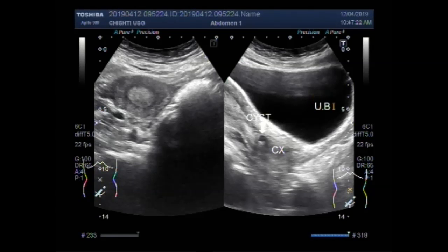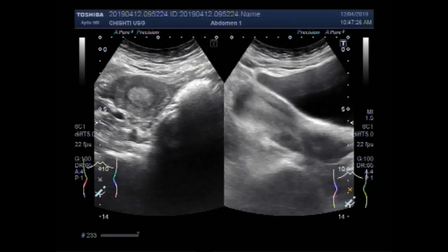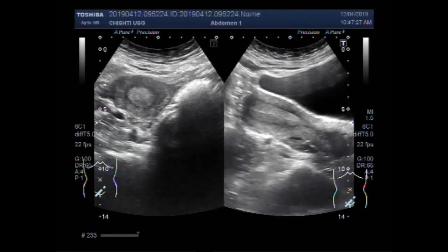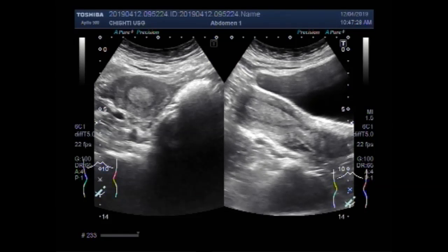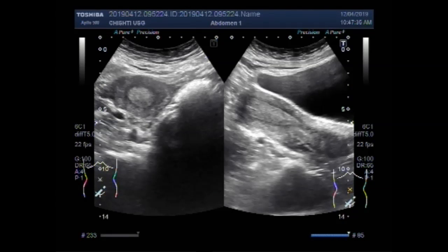This is the urinary bladder. Again you can see the polyp in the uterus.